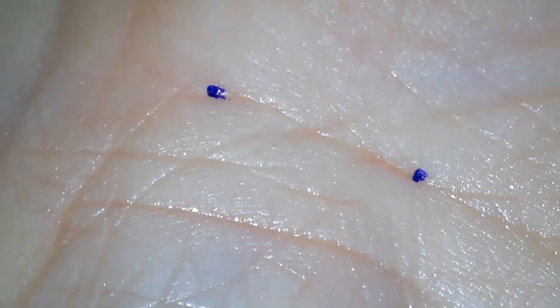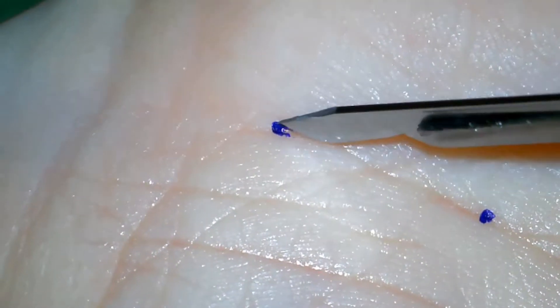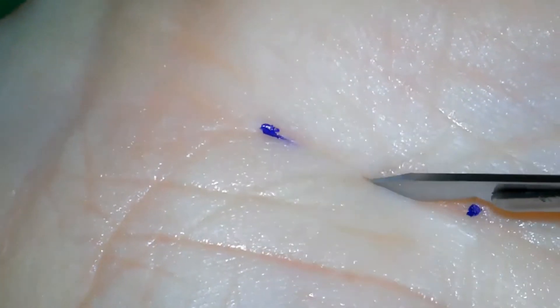The skin incision is marked and a pre-existing crease is used for the incision. The skin incision is then made with the scalpel.